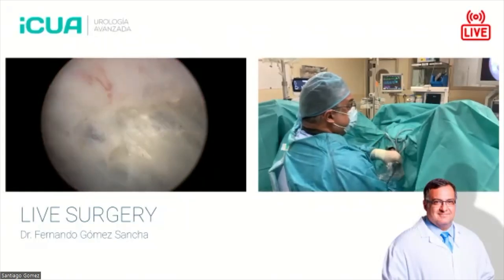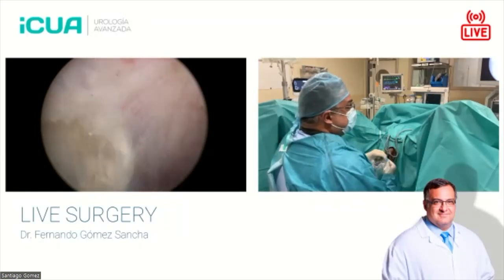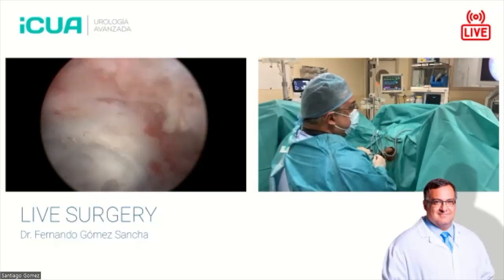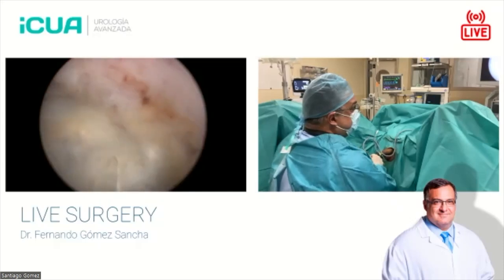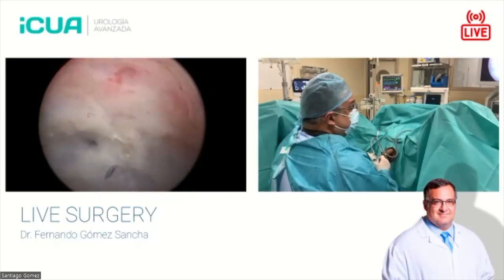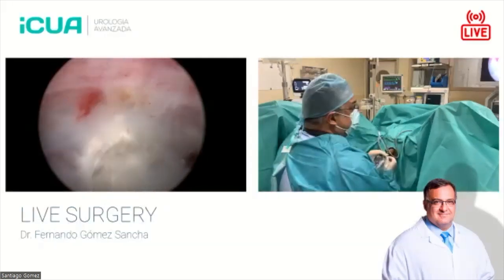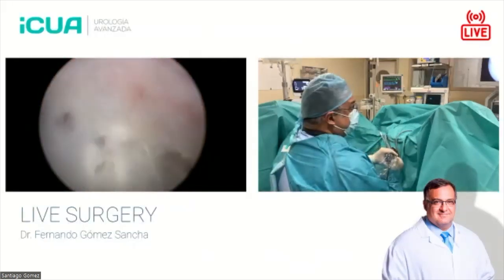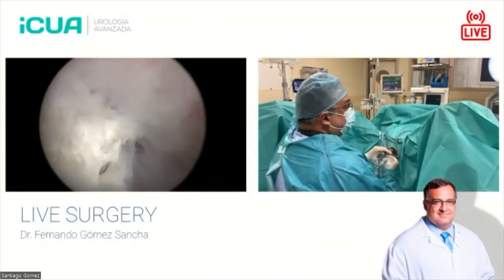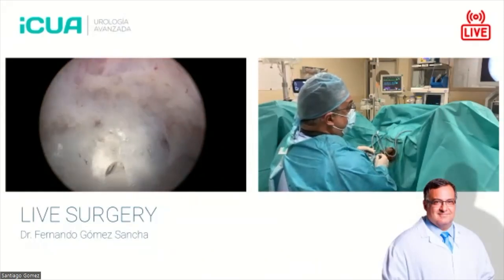As I said, instead of going very deep in one place like this, I go from side to side. I do very wide movements, because wide movements allow me to have a uniform line. We were discussing before the settings of the laser, and maybe Marek, you didn't see that. Settings are important, but they're not the only factor that determines tissue laser interaction. So if the first factor is the settings, factor number two would be working distance.